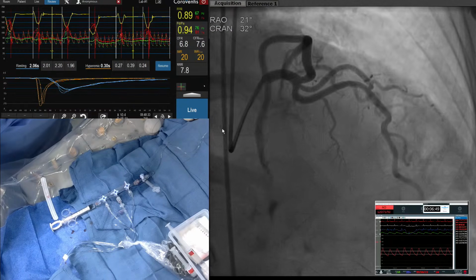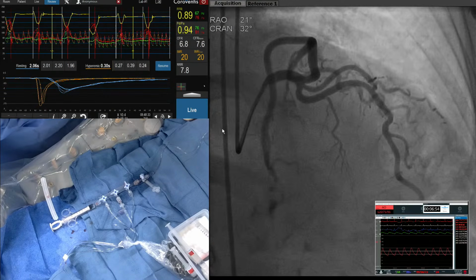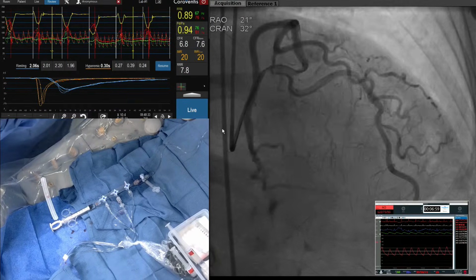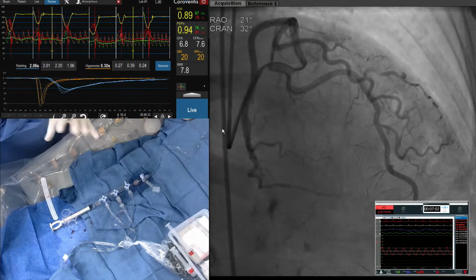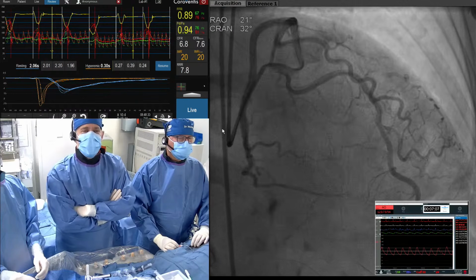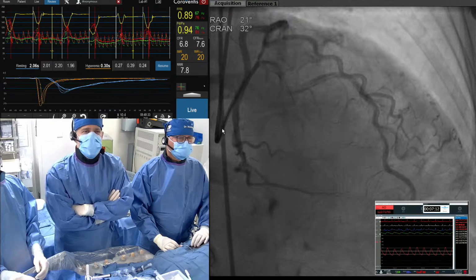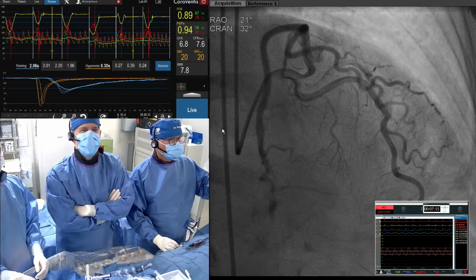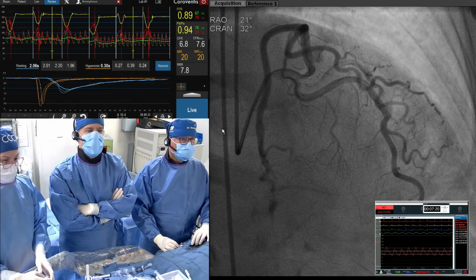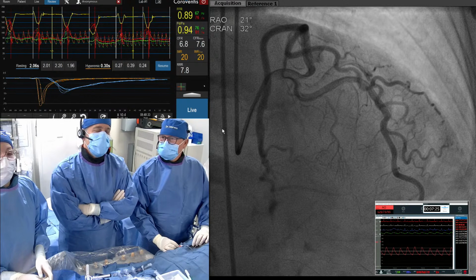So that's below 25. It's all normal, very normal. Her resistive reserve ratio is 7.8. That's not a newer one, but anything more than, I say, 2.7. I don't know what you use for that. If it's less than that, that's more indicative of badness, if you will. But hers is 7.8. I like your interpretation of the resistive reserve ratio. I think it's prognostic, right? Less than 2.7 says that you can't vasodilate properly and leads to bad outcomes, but it's hard to put it in the context of symptoms. Right. But overall, I would say this is a pretty normal study.